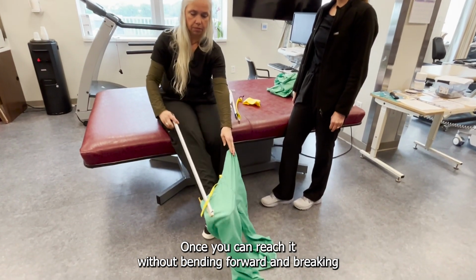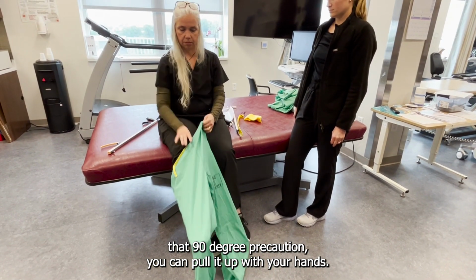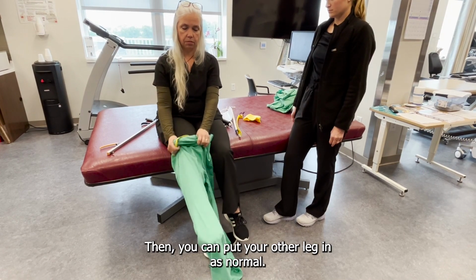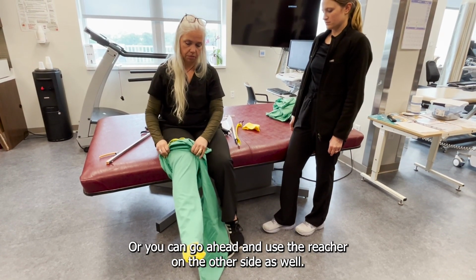Once you can reach it without bending forward and breaking that 90-degree precaution, you can pull it up with your hands. Then you can put your other leg in as normal, or you can go ahead and use the reacher on the other side as well.